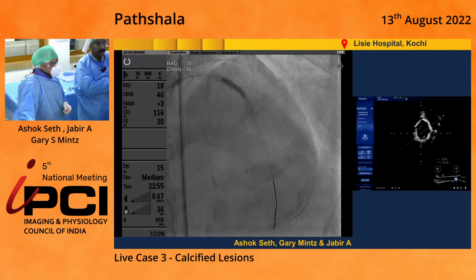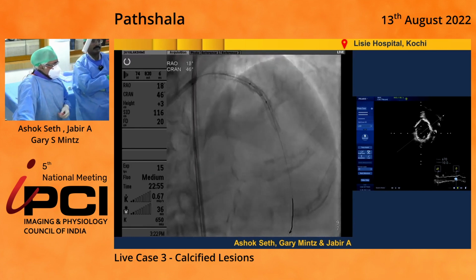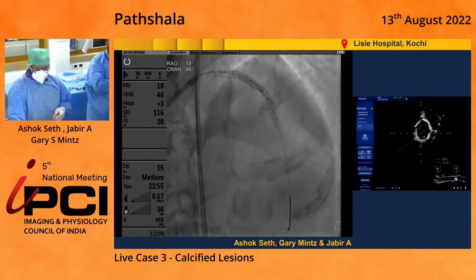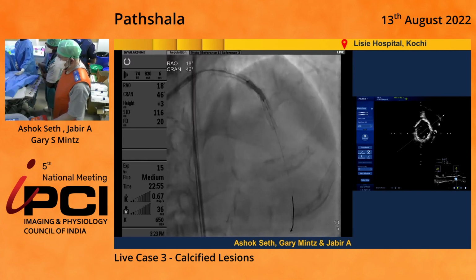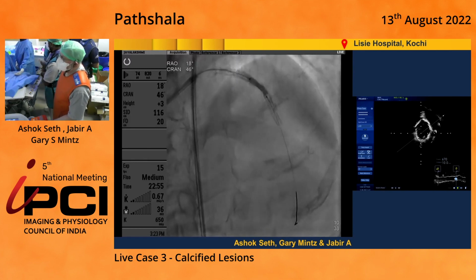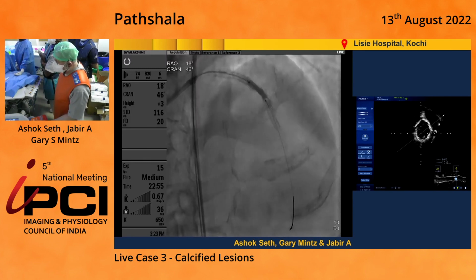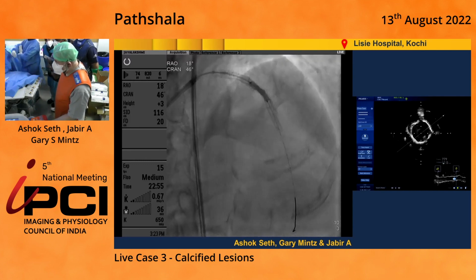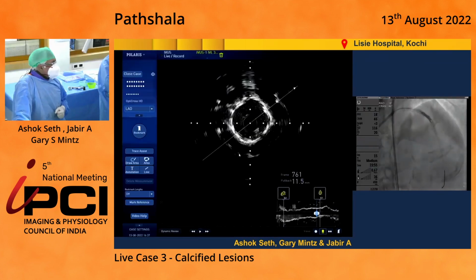We felt that we could again check it up with IVUS, and so Gary has looked at the IVUS. Gary, any comments on a repeat IVUS after the 80 cycles? Sure, a couple things. The MSAs have essentially not changed, but there are a couple of areas where there appear to be cracks in the calcium. Like there's one here. And if we look, we can see not only reverberations, but some suggestion of penetrating some of the calcium with ultrasound. So this is an inferential that we have created some cracks.